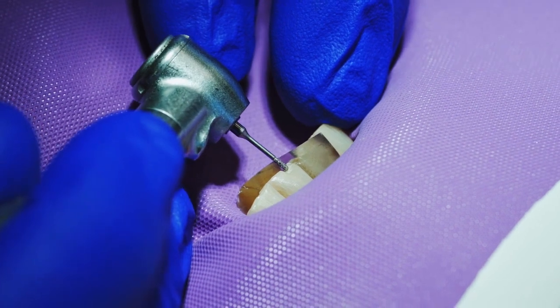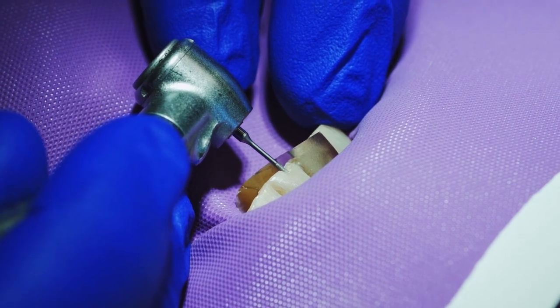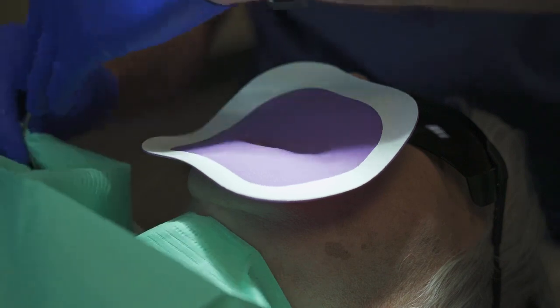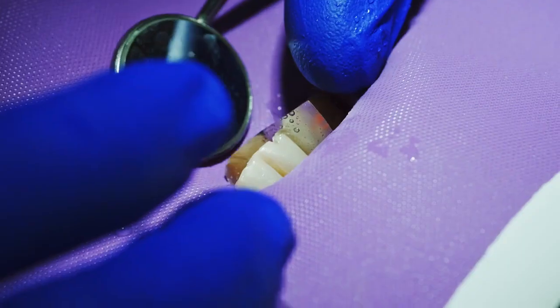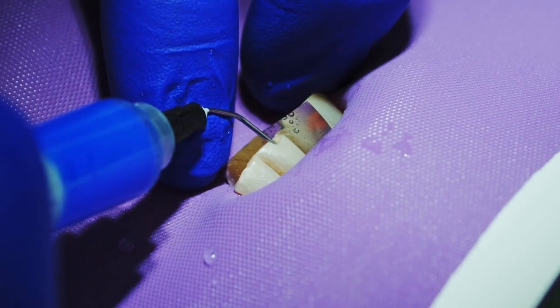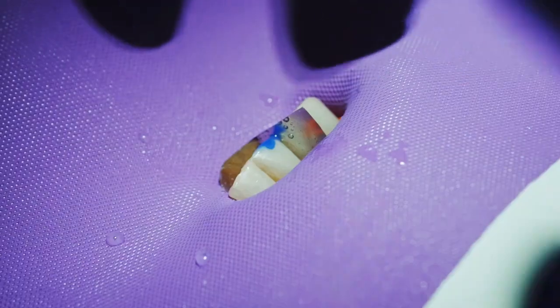We'll use this burr to make a small hole in this space. I like to acid etch that space to make sure we don't have any tooth fragments in the hole. Let that sit for a few seconds, then rinse it.